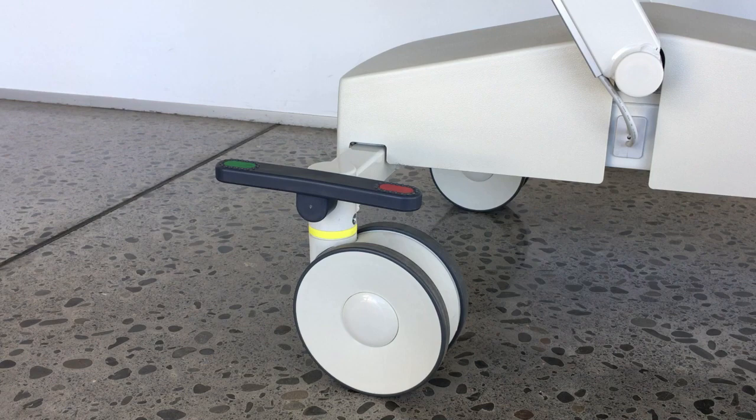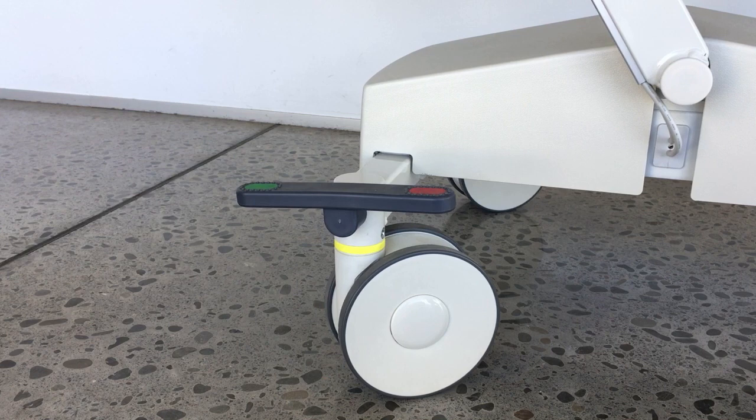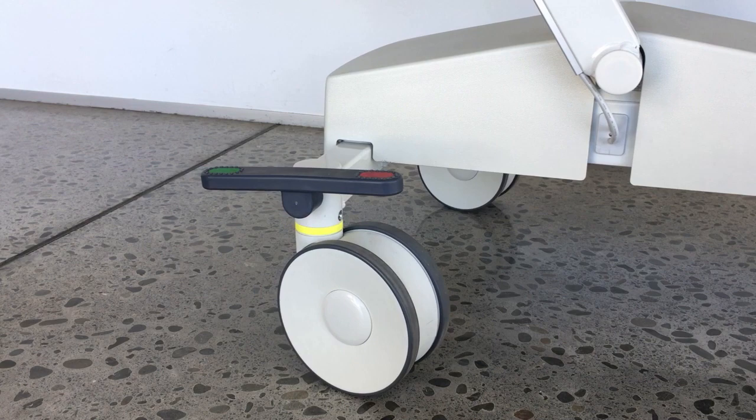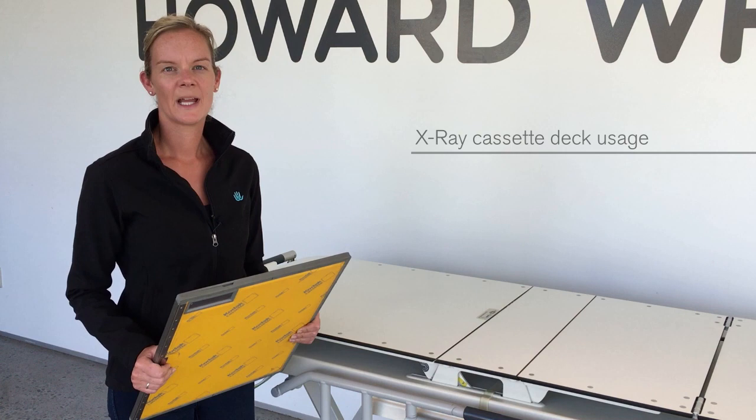Caster pedals can occupy three positions: brake, neutral and steer. To engage the brake, press the red pedal and all four casters will lock. To engage neutral, set the pedal to a horizontal position — the stretcher can then be maneuvered in any direction. To engage steer, set the pedal to the neutral position, push the stretcher a short distance in the direction of travel, and then press the green pedal. The Staircaster is now locked in line and the stretcher is ready to go.